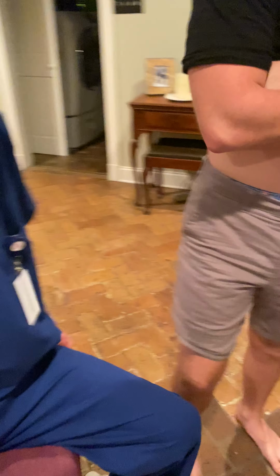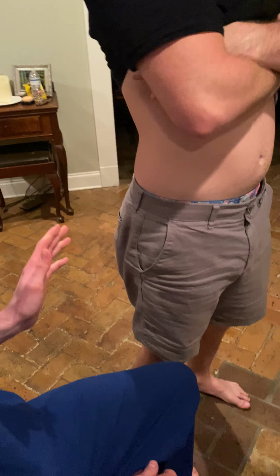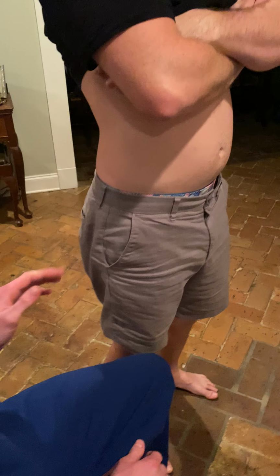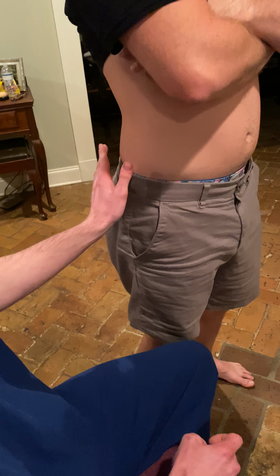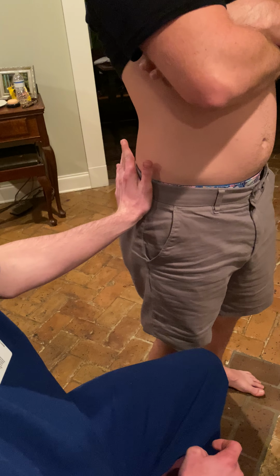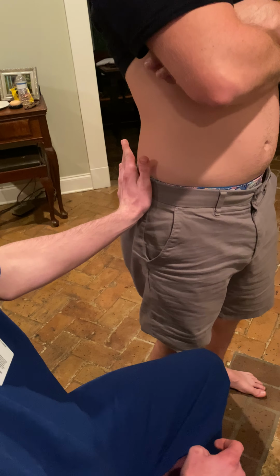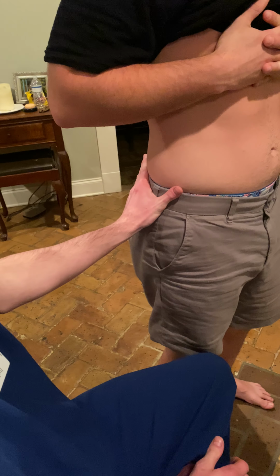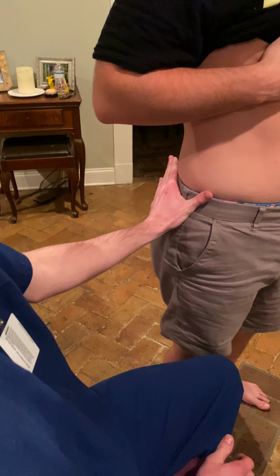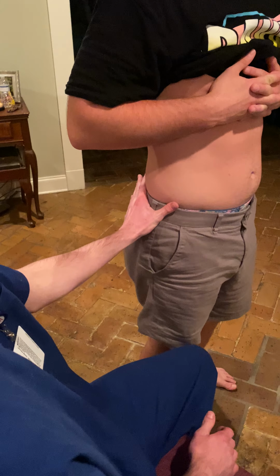Then for the third injection site, it is the ventrogluteal, and I would have the patient lay in a supine position, and I'll take my opposite hand from the patient and locate the greater trochanter with the heel of my hand. My thumb would be pointing towards the groin, and my index finger towards the anterior superior iliac spine.